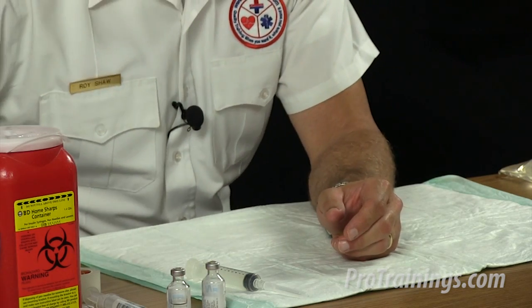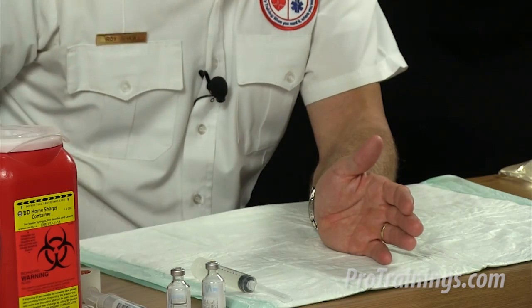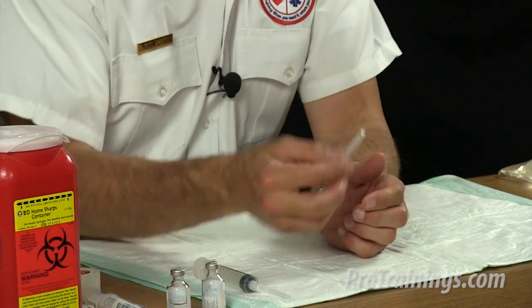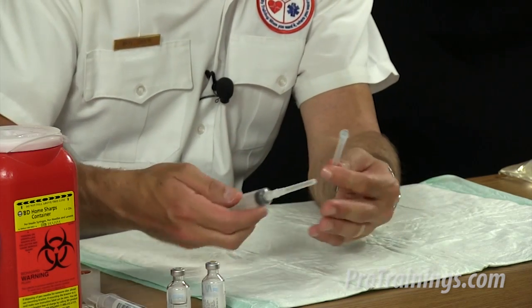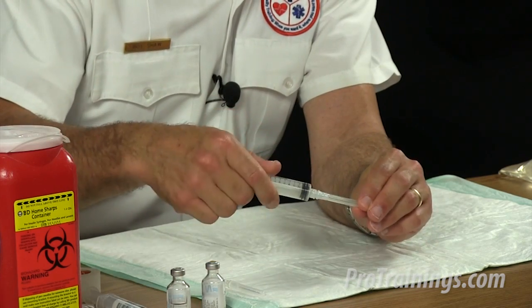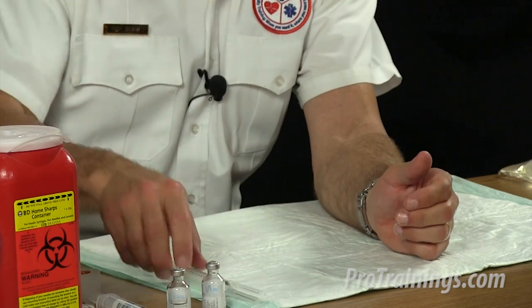Again, having gloves available is always a good idea. Having multiple available in case one gets contaminated is important. And then changing gloves in between patients and in between the different types of tasks that you're doing. An example of a needle that's still capped, you can see this here, it's not done yet. So, if we're changing needles, you're going from the actual drawing up to the actual injection needle. Again, this is all going to be done with aseptic and clean technique.